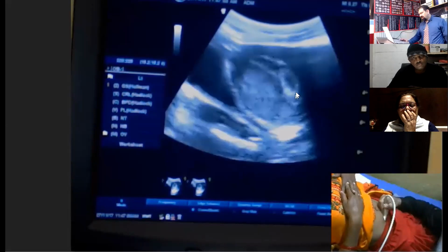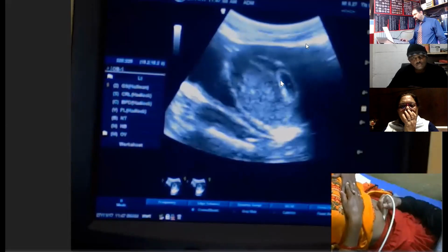Another one. So this is the gestational sac over here. This gestational sac is having a good decidual reaction. So this is the decidual reaction, and this is the unobliterated uterine cavity. Why, Dr. Shanti, is this important? Sir, these things are discussed with you during the class. I'm just giving you a quick recap. To rule out pseudo sacs. Very good.